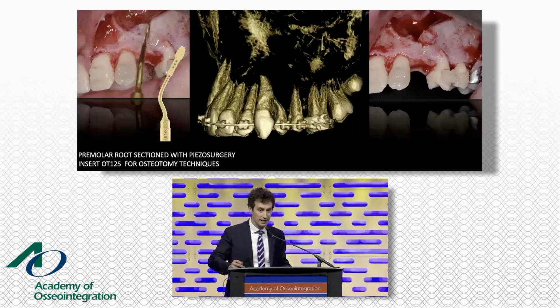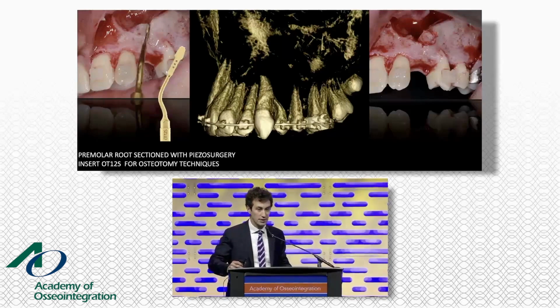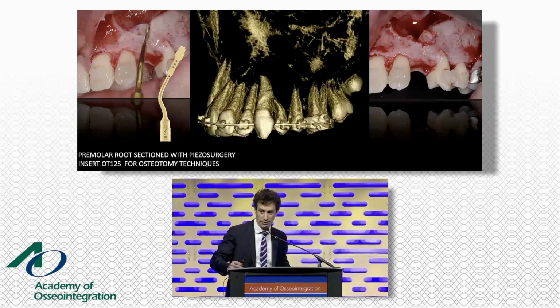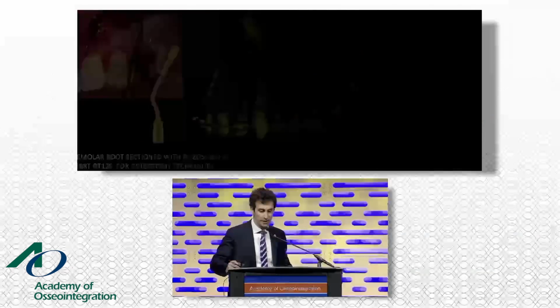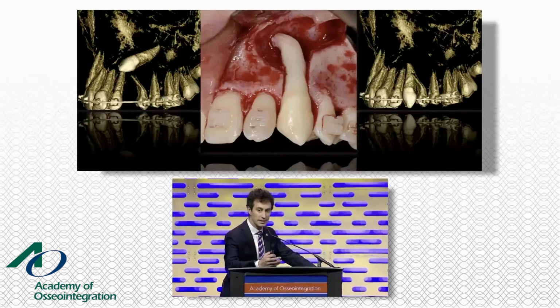So during the surgical procedure, with a sterile technique, we decided to cut the lower third of the premolar root to create the space to fit in our cuspid, and then we fitted the cuspid in that space. So what is the rationale behind this kind of procedure?